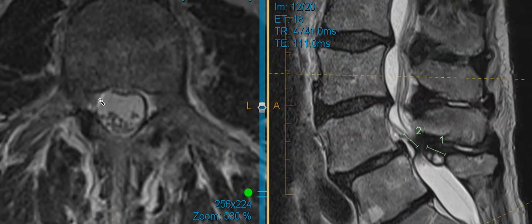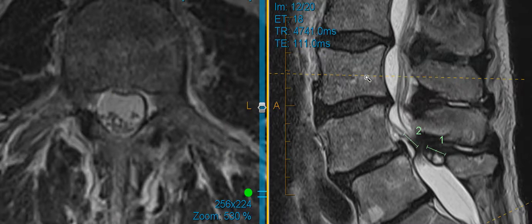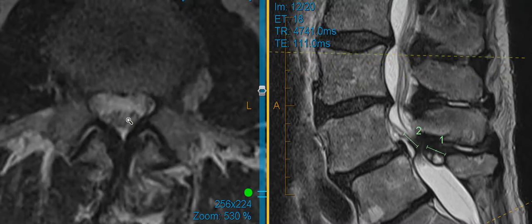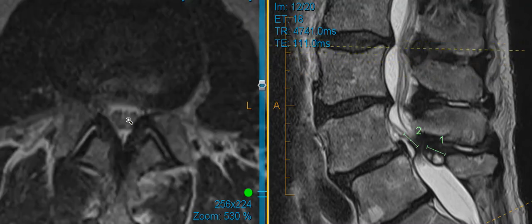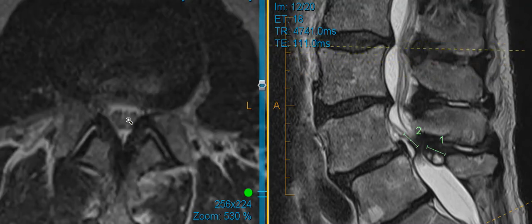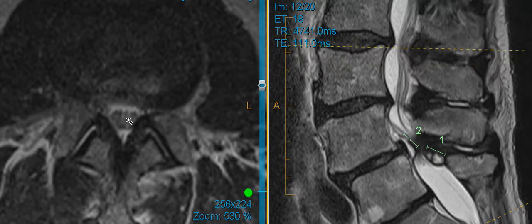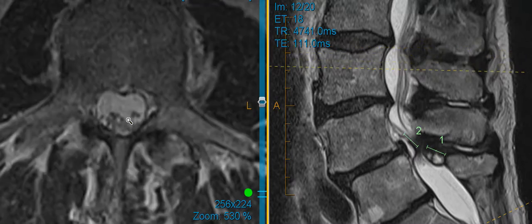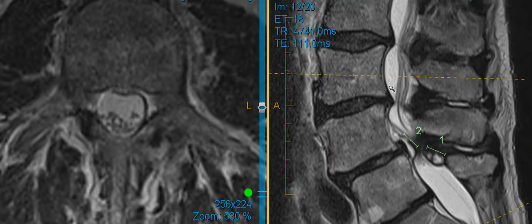So if we keep crawling up, you can see this cross-sectional line correlates to this segment here. Come up to these other levels. There's a mild amount of narrowing at L2-3, nothing that I'm really concerned about, but this is good to note. At this segment, which is right in between the discs, the spinal canal is totally open.